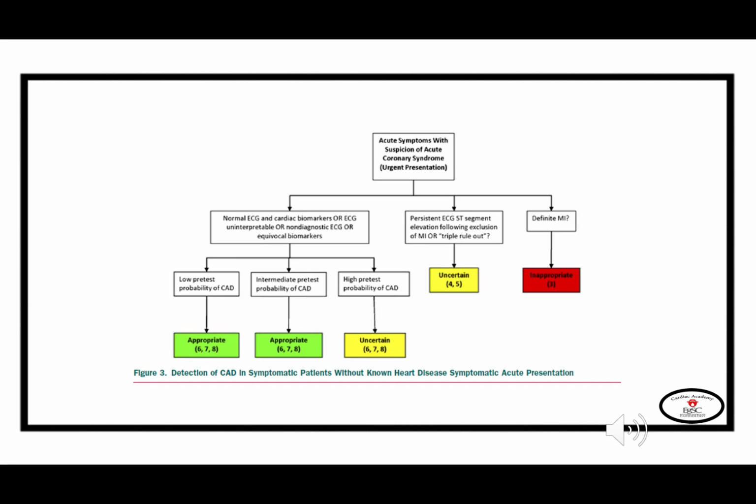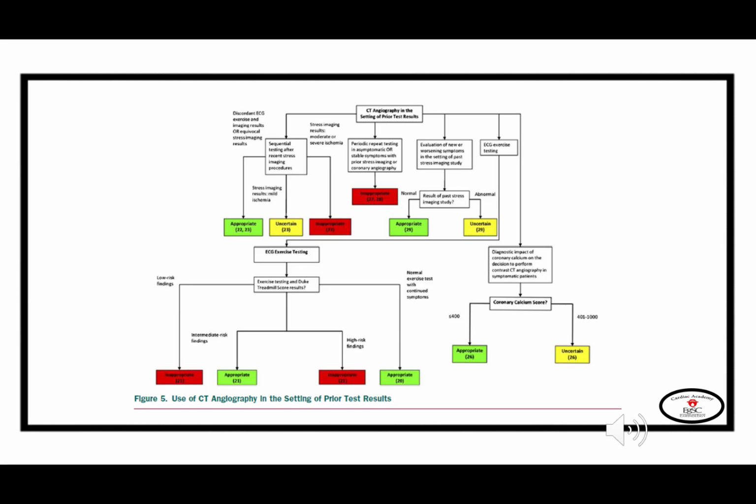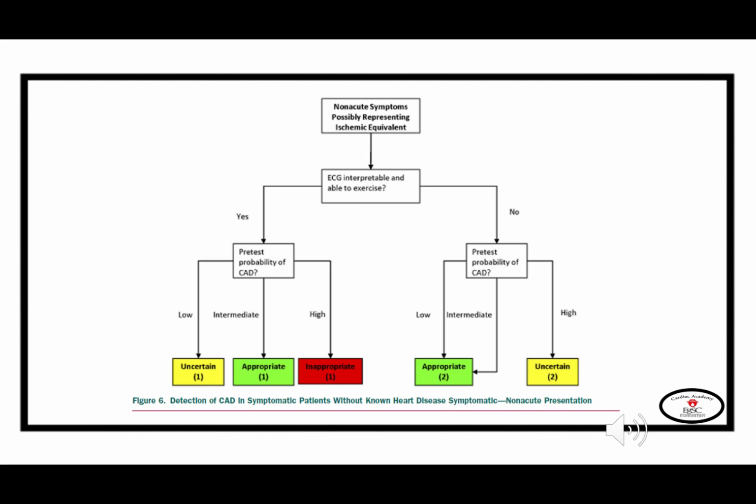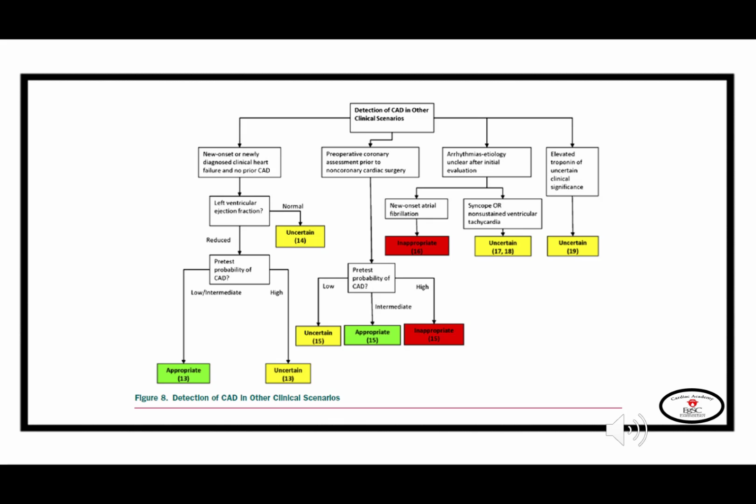Different clinical scenarios exist in terms of acute symptoms, post-revascularization algorithm, in the presence of prior test results, presence of non-acute symptoms, evaluation of asymptomatic patients, detection of coronary artery disease in other scenarios like the presence of newly diagnosed clinical heart failure, preoperative coronary assessment for non-coronary cardiac surgery, and detection of arrhythmias and the cause behind it.